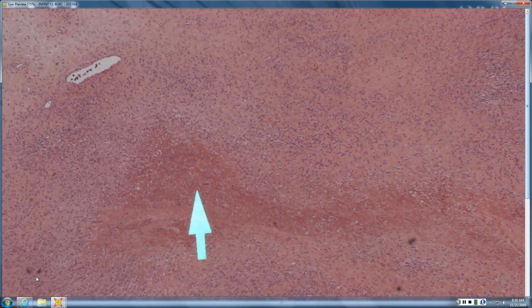So you have to look at the patient. So rheumatoid nodule versus deep GA depending on the patient, whether or not they have RA or rheumatic fever.